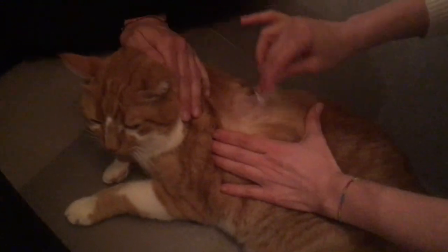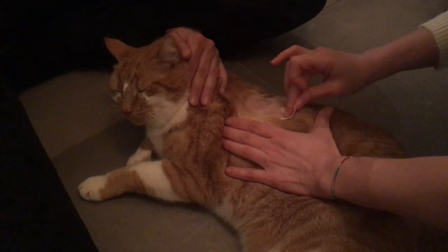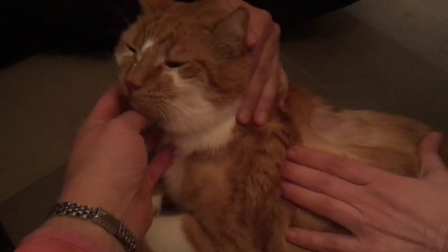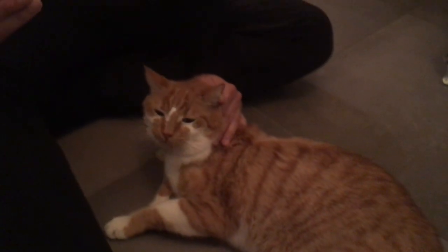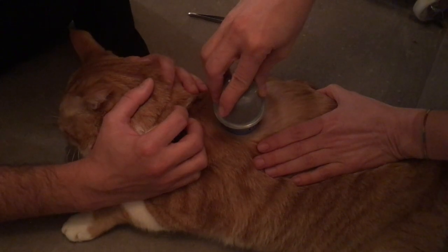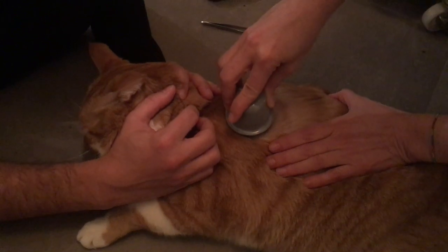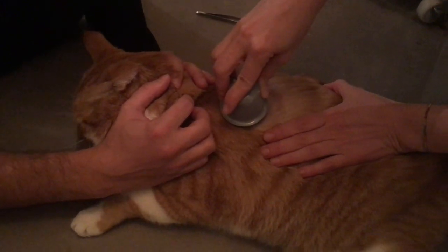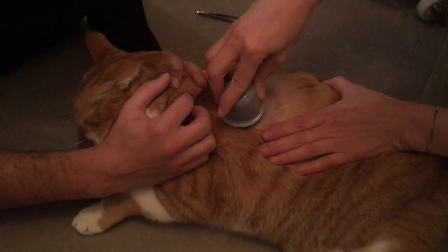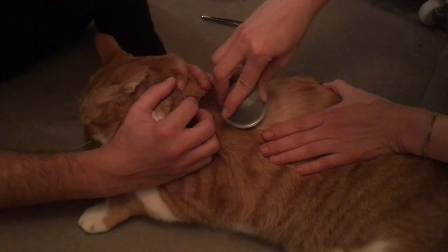Now we're removing all oil from the skin. Jean-Guy is a really nice cat. You apply the device and just press slightly and it goes in. The needle goes in the skin, so that's a bit startling sometimes — sometimes the cat reacts, sometimes it doesn't. And you keep it in place for 30 seconds so that the glue has time to set.